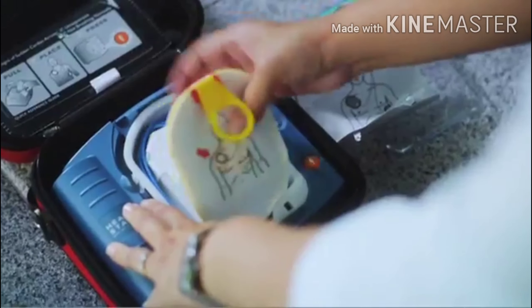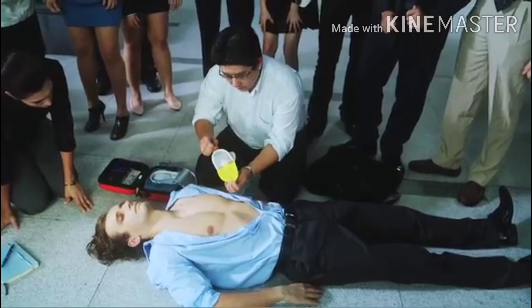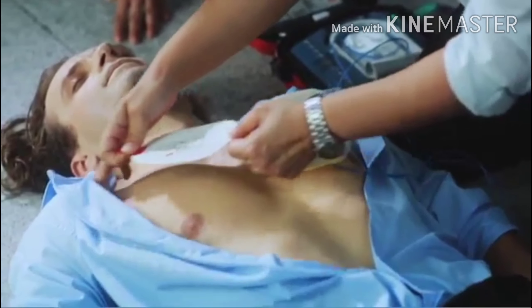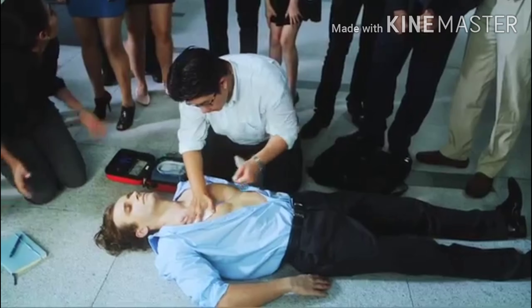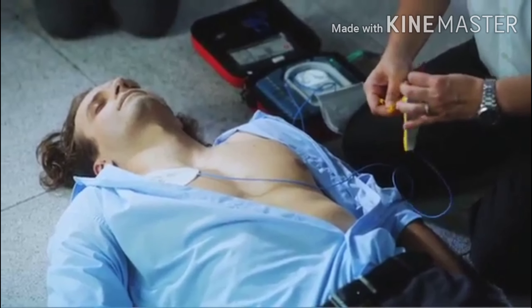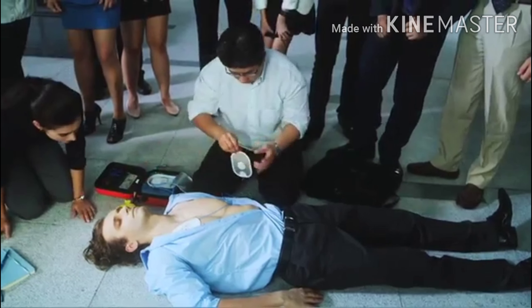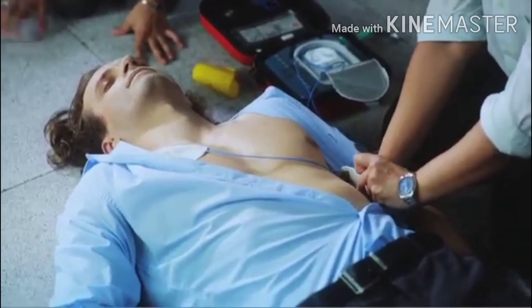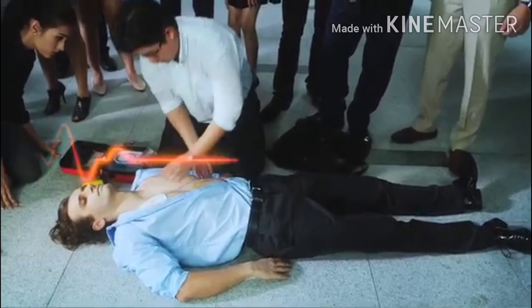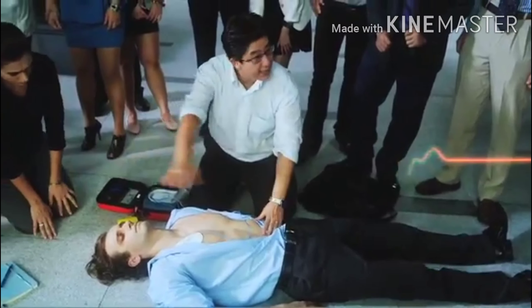Begin by removing all clothing from the patient's chest. Place one pad exactly as shown in the picture. Press firmly to the patient's bare skin. No one should touch the patient.